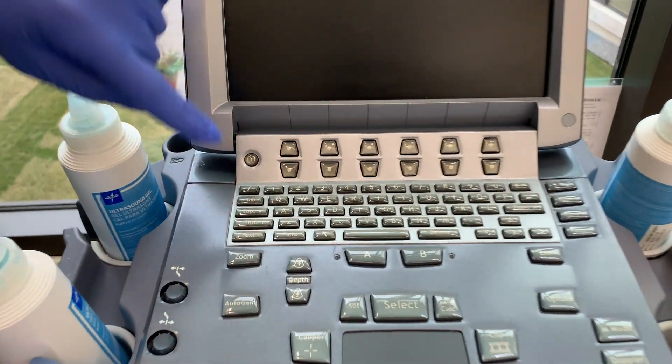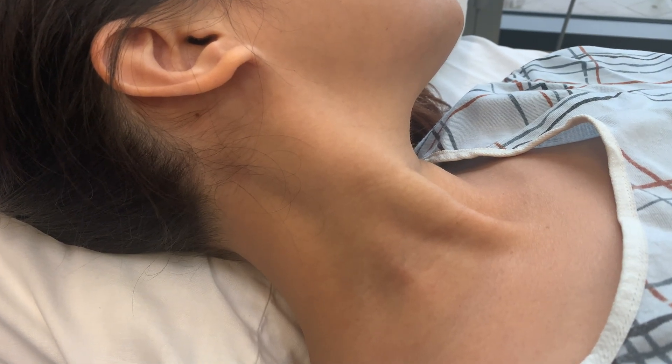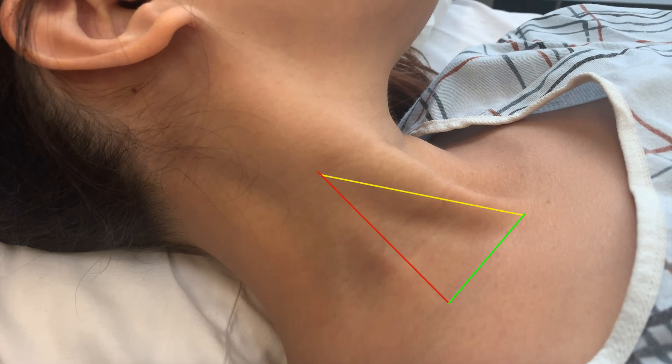Place the ultrasound machine on the opposite side of the patient and turn it on. Next, place the patient supine in a slight Trendelenburg position with the head turned away from the provider. At this point, identify the anatomical landmarks of the sternocleidomastoid muscle and clavicle.